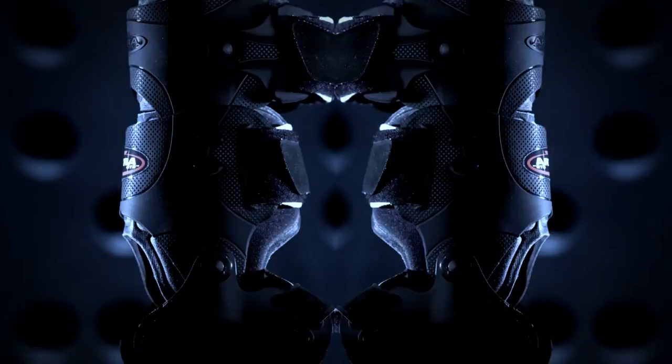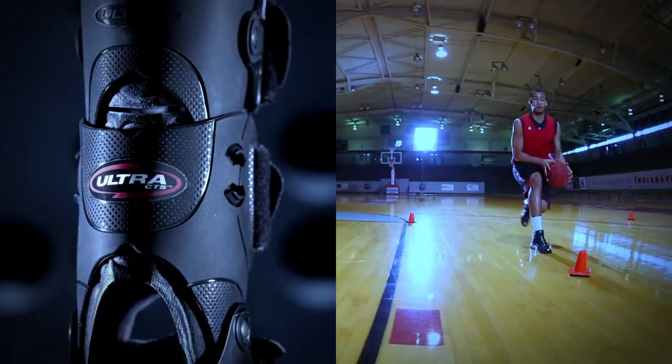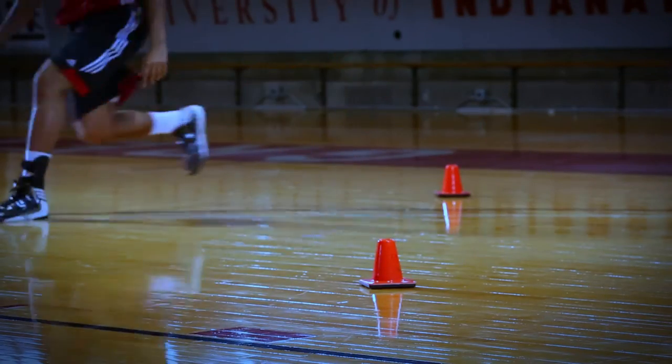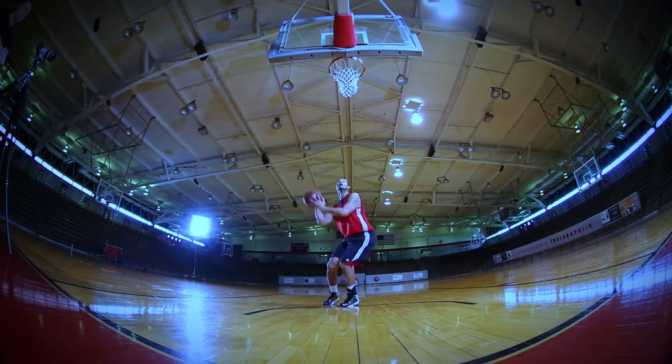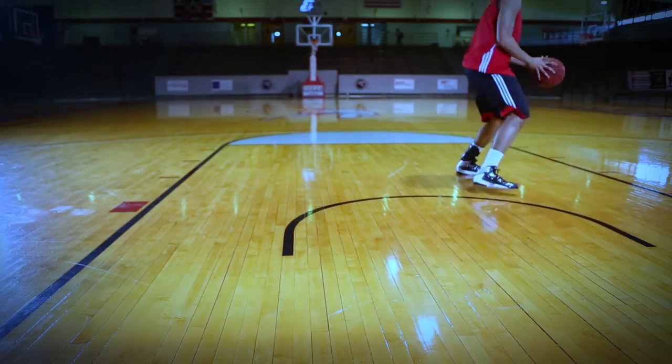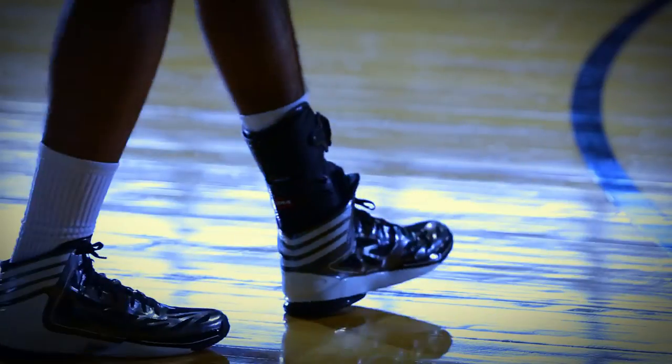Treat and rehabilitate the acute ankle injury with our Ultra CTS custom treatment system. Snap in the PerformaFit upright for maximum acute injury support. Snap out for low-profile active rehabilitation. Total ankle injury management in one ankle brace.